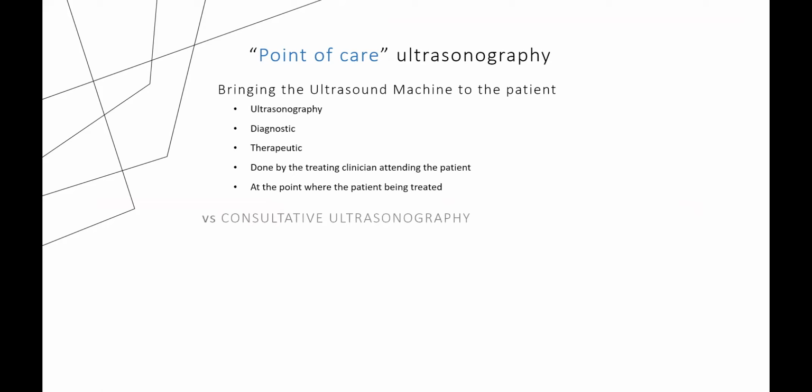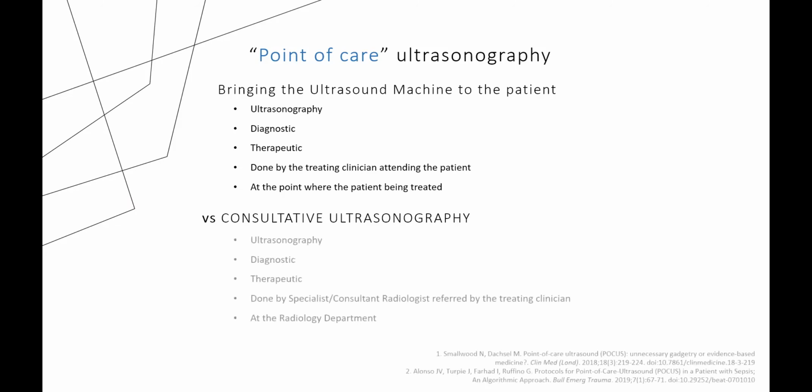Okay, so this is very different from and in contrast to consultative ultrasonography, where it is also ultrasonography. It is most of the time diagnostic and can be therapeutic depending on the situation. And it is done by the specialist or consultant radiologist referred by the treating clinician. Okay, and it's done at the radiology department. This is where we bring the patient to the ultrasound machine.